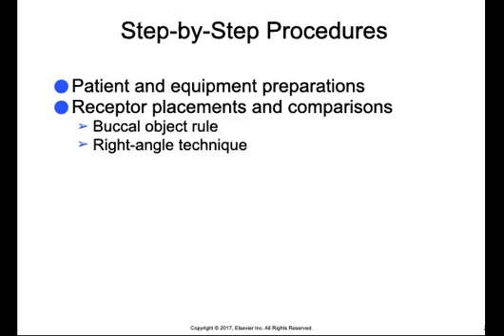So the step-by-step procedures for localization techniques include patient and equipment preparations, as well as receptor placement and comparisons. So we'll use the buccal object rule as well as the right angle technique.